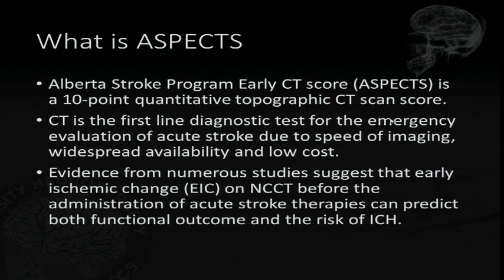And then we get to the ASPECTS, which probably about half of you report. So we need to report it more often. And the more often you report it, the more comfortable you're going to be with it. Don't think it's all or nothing, like 9 or 10 or 8. You can give a range. So if you have a 9-ish or a 10-ish or an 8-ish, or a 9 to 10, or 8 to 10, that's fine.